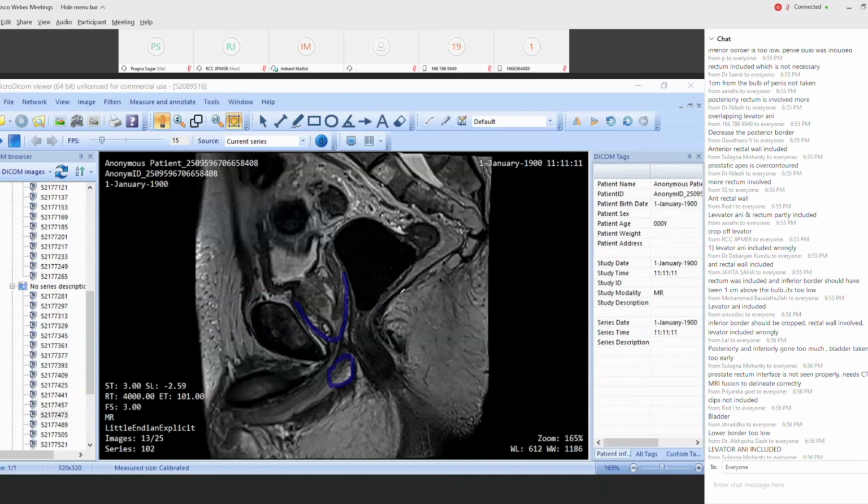In relation to urogenital diaphragm, one query was: does inclusion of the diaphragm in CTV add to toxicity? Well, certainly. The longer your contour is inside the urethra, there will be a contribution to toxicity. This is of more importance in radical radiotherapy for prostate cancer. So if you unnecessarily contour into the urogenital diaphragm, you will most certainly cause more toxicity.